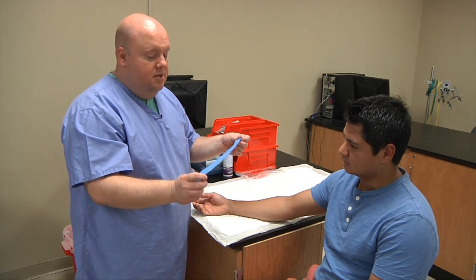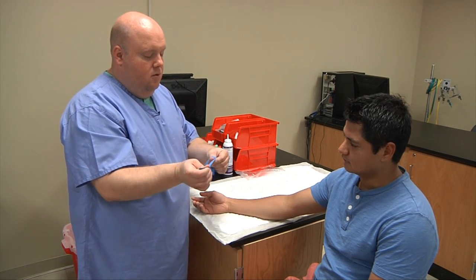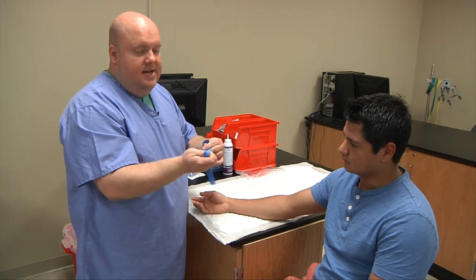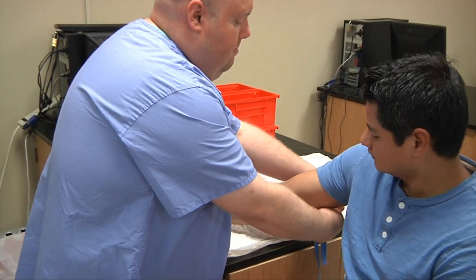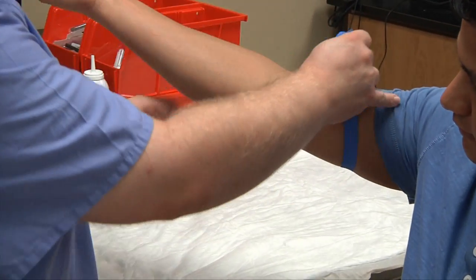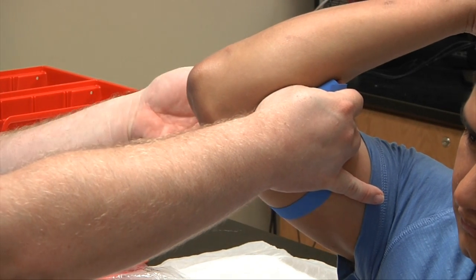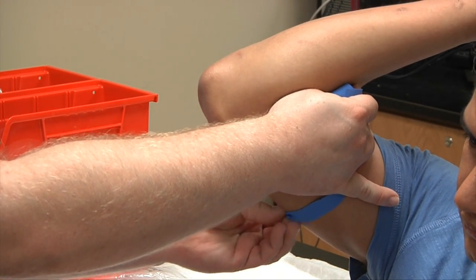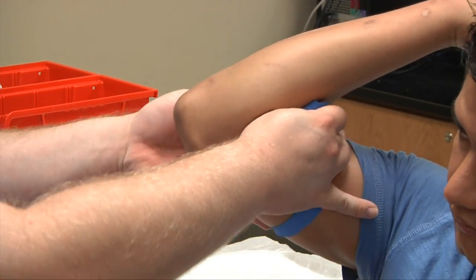We have our non-latex tourniquet — make sure it's good and intact, no rips or tears, and no signs of soil on it. Place it around the patient's arm and keep it flat in the back. It should be smooth and flush; we try not to let the tourniquet roll as that will cause the patient extra pain.